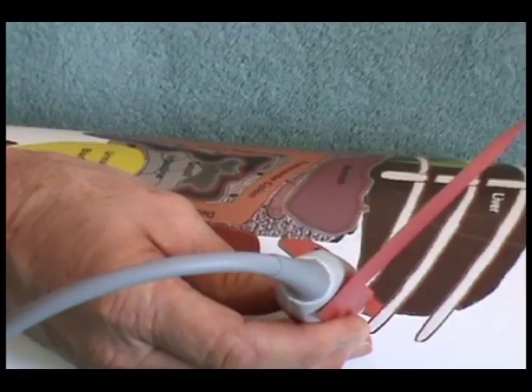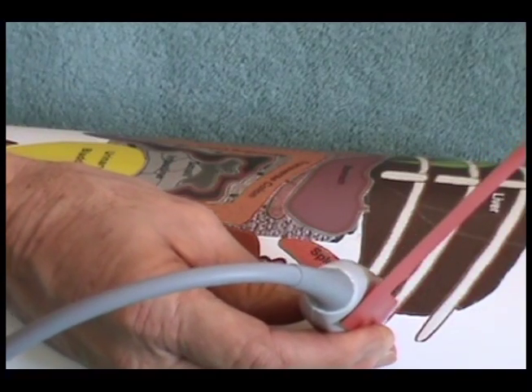In cats, the spleen is usually small and can be seen in a single pass.